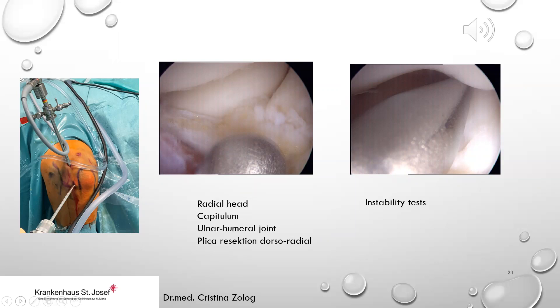Through the soft spot portal we can identify the radial head, the capitellum, and the ulnohumeral joint. At this point in the surgery, we can identify and resect a dorsolateral plica, for example, and perform with the trocar the important instability test for the LUCL, RCL, or annular ligament. Sometimes it is impossible to visualize all these structures because of an extended plica, so you must start blindly with a shaver and resect it.